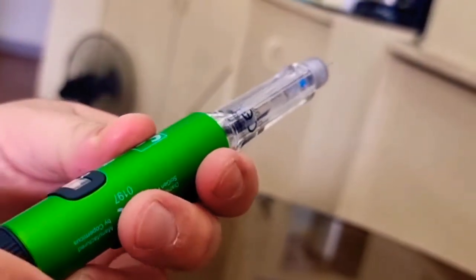Great. 1, 2, 3, 4, 5, 6, 7, 8, 9, 10 for the dispense. So everything is fully administered inside before you pull it out.